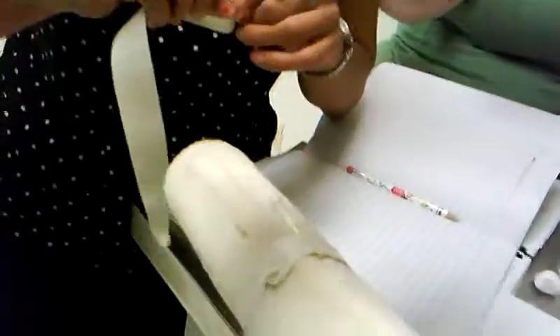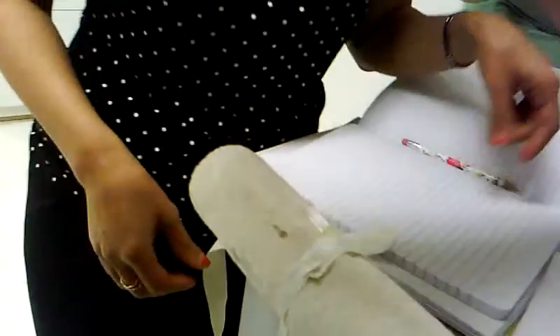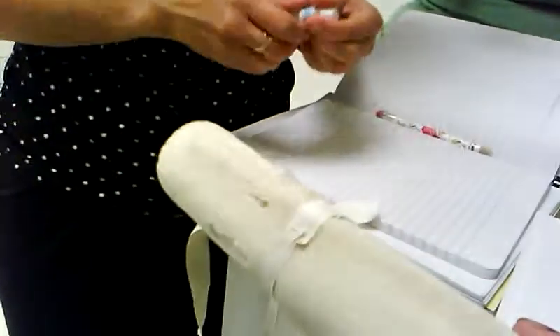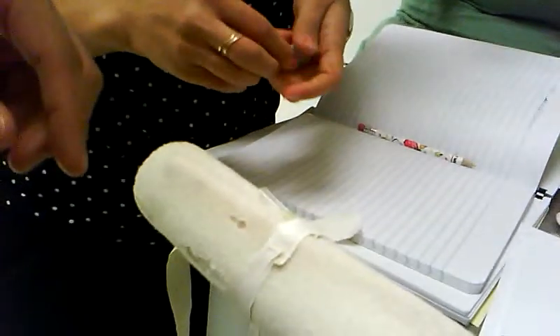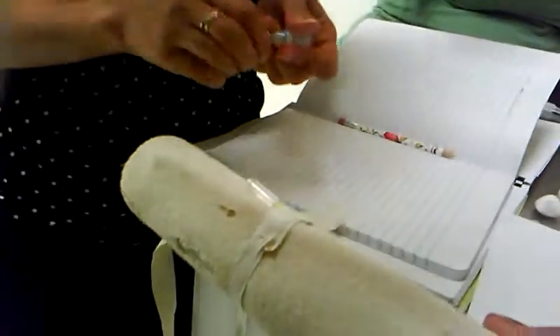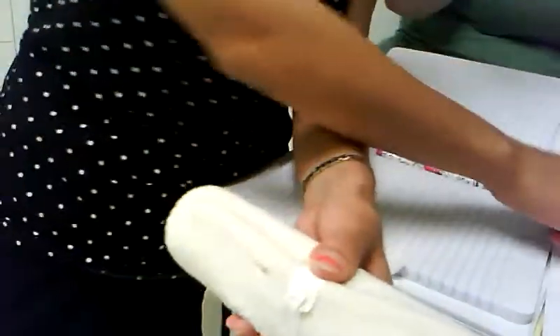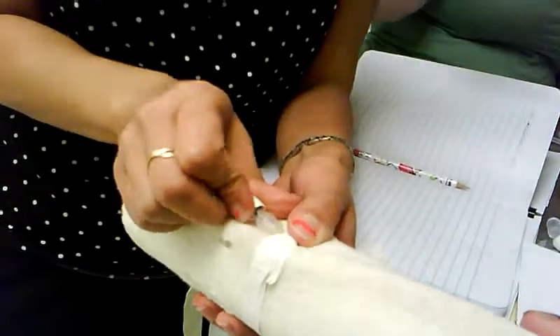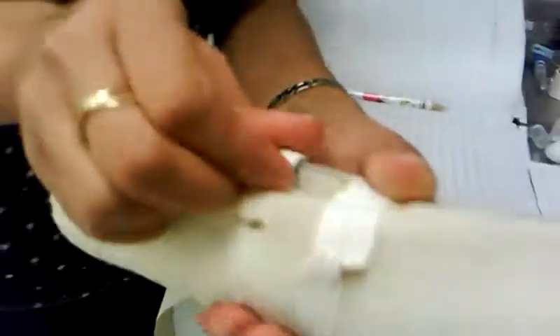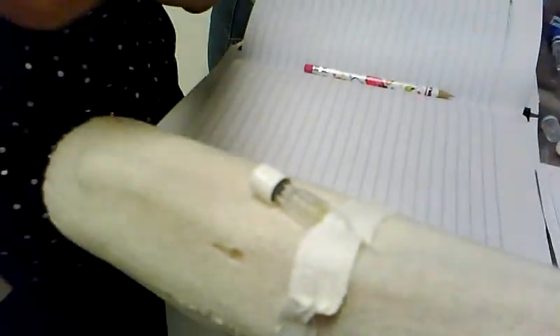This is where you flush. This is when you put your cap on now. And then you flush your heparin. Grab your new cap. Make sure you cross over — make sure you go along the middle. Take that off, twist that on. And then you flush right, and then you put your cap on and flush.